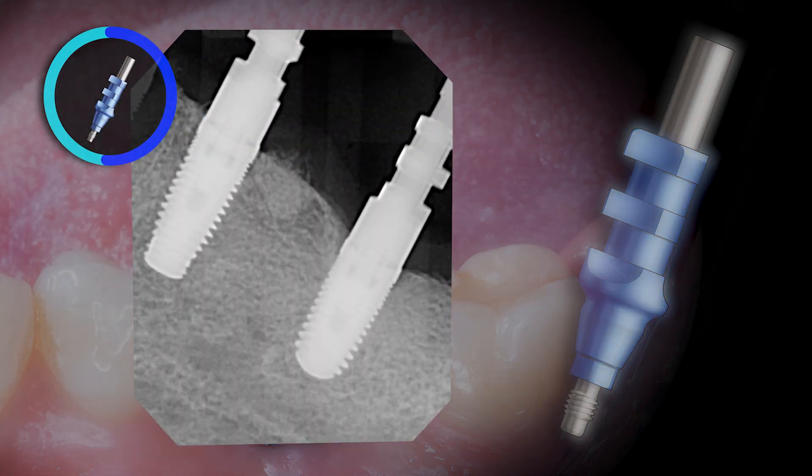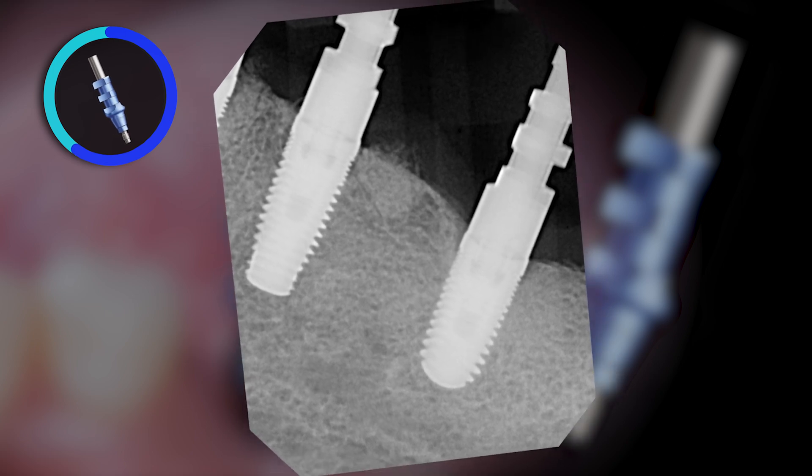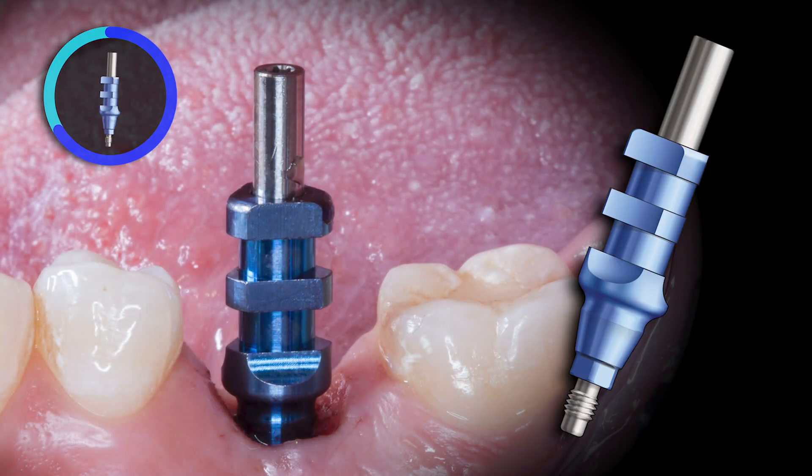Again, radiographic confirmation is recommended to ensure there are no interferences of either hard or soft tissues and that the coping is fully seated. This is my impression technique of choice as the coping stays in the impression, leaving less room for error.